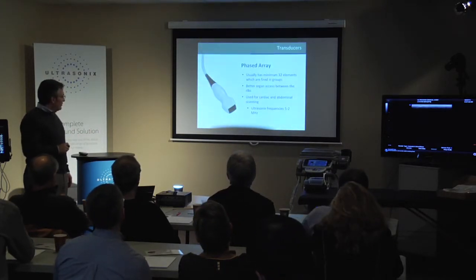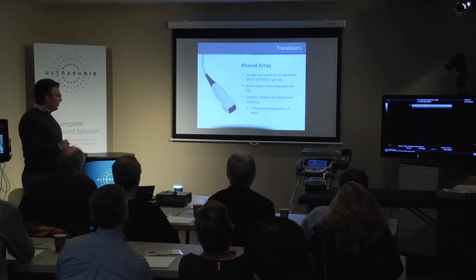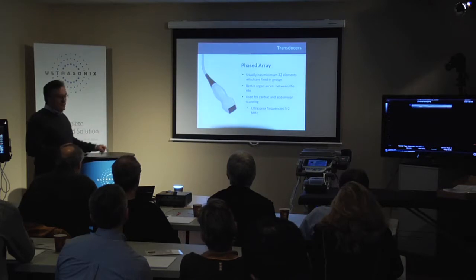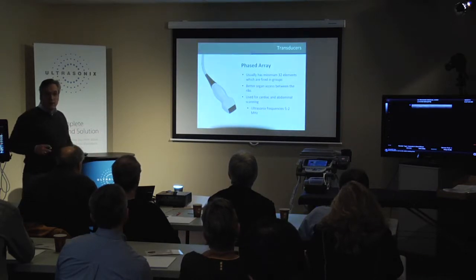Here's another probe that you may recognize. It's a small part. It's a phased array probe with a small footprint. We utilize this largely for cardiac and also intercostal, which assists with access for the window.